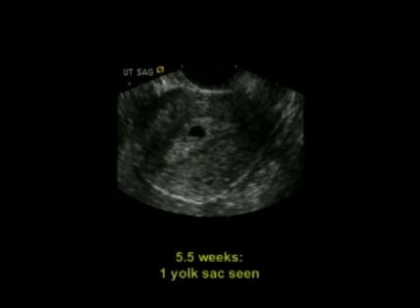So this is a woman who had a positive pregnancy test. We did the ultrasound. We see an intrauterine gestational sac. There's faintly visible within it a yolk sac. So this looks like she has a singleton intrauterine pregnancy.